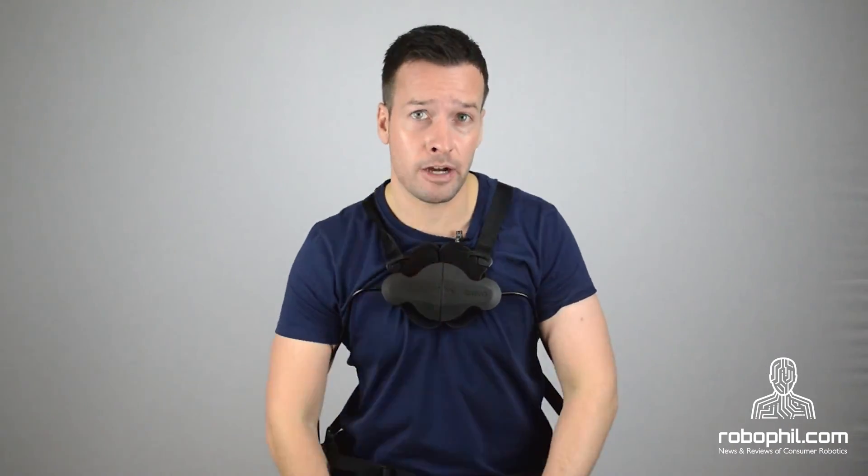Levo likes to think of its device not as a complicated machine, but as a bicycle — something that simply helps a person go further.